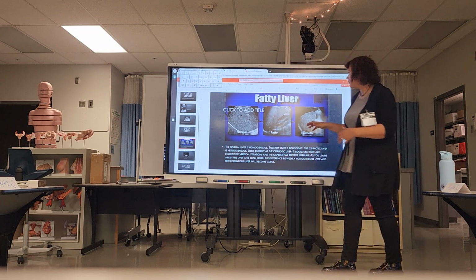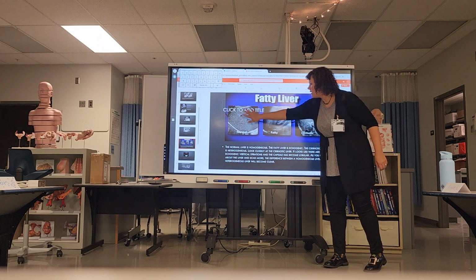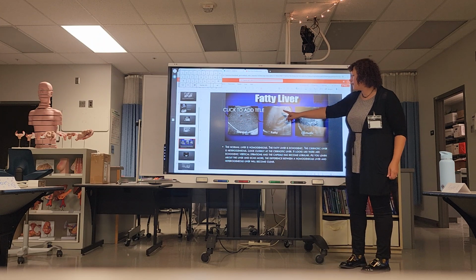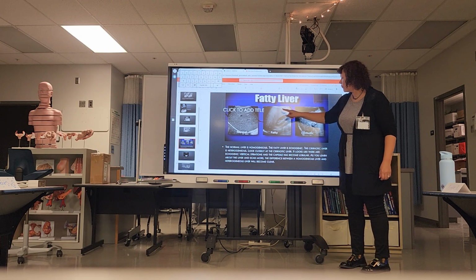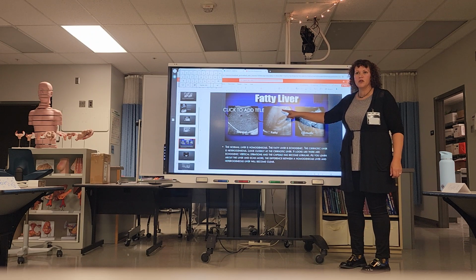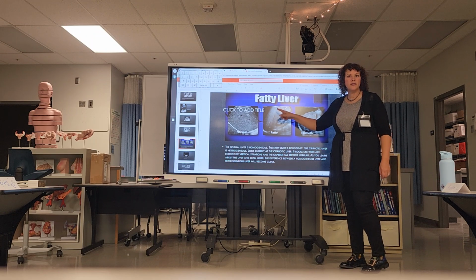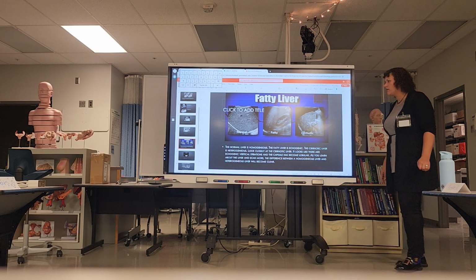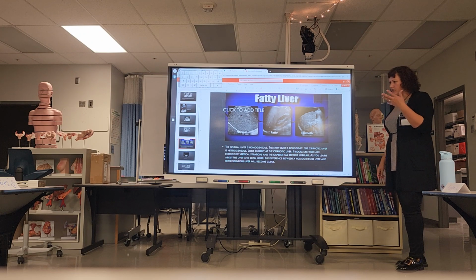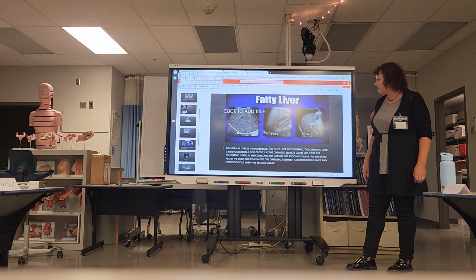Okay, so more examples of a homogeneous liver. Here we have a normal homogeneous liver. This is a fatty liver. It is still homogeneous, but it's really echogenic now. This will probably be the most popular pathology that you'll see out there: fatty liver. So many adults come in with elevated liver function enzymes, and you'll see just a big fatty liver.